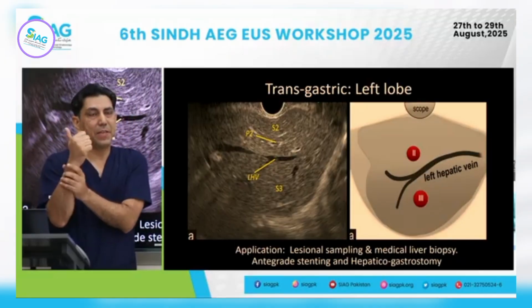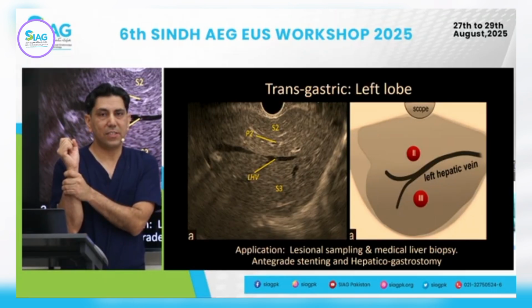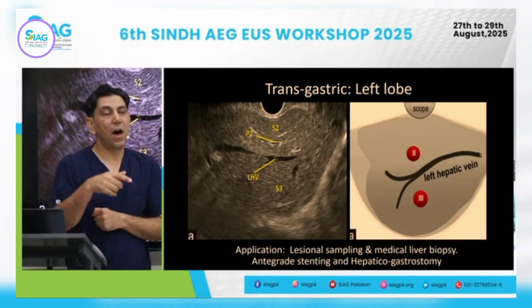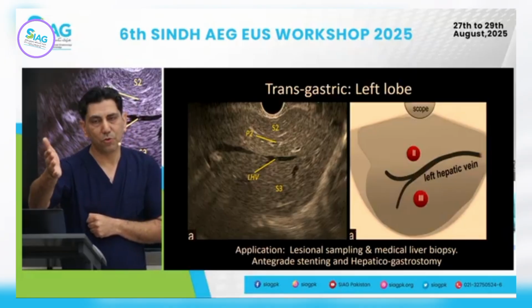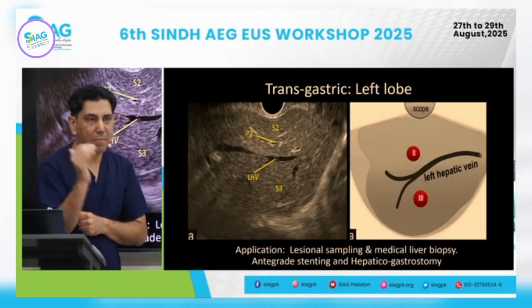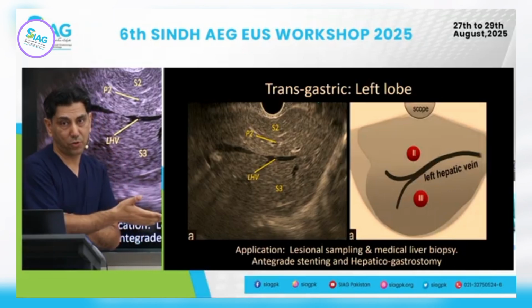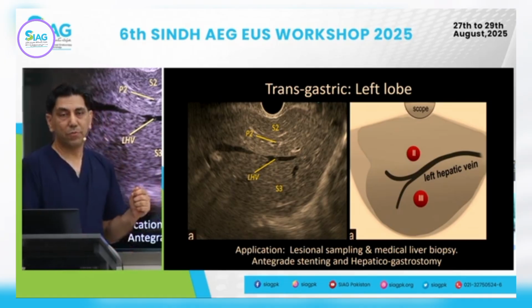In my mind, it helps me in two ways. One, if there's any perihepatic ascites, especially in the cancer cases where you're trying to do the staging assessment, it helps you. And also, if any complication happens as a result of the procedure, I have already documented whether there was ascites or air pre-procedure. So pre-procedure, at base camp, the presence of ascites helps in two ways. For staging, a small amount of perihepatic ascites can easily be missed, which can contribute to the staging of the disease.